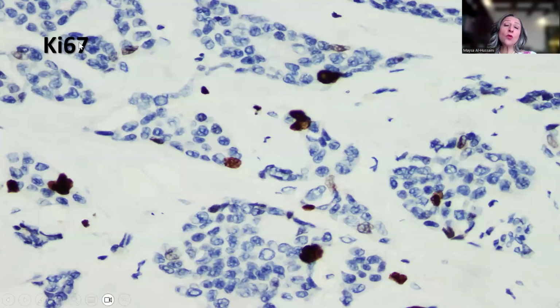Ki-67 also is nowadays routinely done in most, if not all, invasive breast carcinoma, because it helps to better assign the tumor into the good versus the bad prognosis cases. The cutoff usually is 14%. We have to evaluate only the invasive component. These are the foci of the invasive component, and as you can see, the estimation was definitely less than 10%. So this is less than 14%, the cutoff that is usually used to differentiate the aggressive tumors, luminal B type invasive breast carcinoma, from luminal A, the good prognosis breast carcinoma.